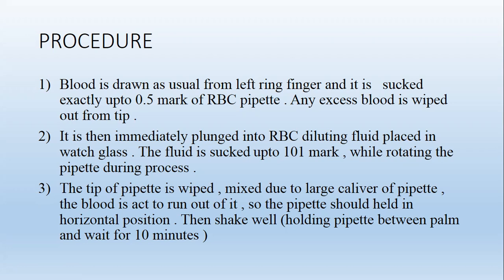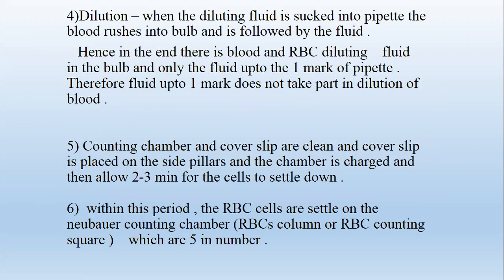Then shake while holding the pipette between the palms and wait for 10 minutes. When the diluting fluid is sucked into the pipette, the blood rushes into the bulb and is followed by the fluid. Hence, in the end there is blood and RBC diluting fluid in the bulb, and only fluid up to the 1 mark of the pipette. Therefore, fluid up to 1 mark does not take part in dilution of the blood. The counting chamber and cover slip are cleaned, the cover slip is placed on the side pillars, the chamber is charged, and then allowed 2–3 minutes for the cells to settle.